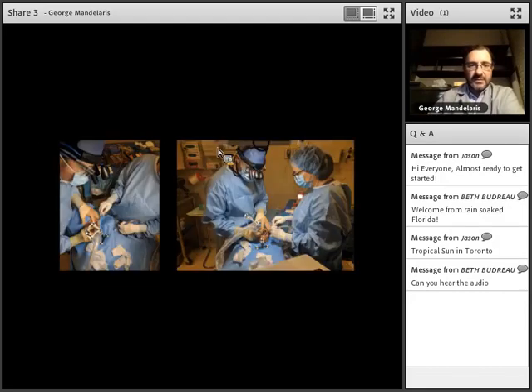access deviations are correct. So real-time verification and validation of positional accuracy, which is really something that we've been needing for a long time in implantology, and something that we have at our hand today, thanks to Duran and everybody at Navident. So again, it's interesting getting used to this, because here I am looking at a computer screen, really not looking at the patient.